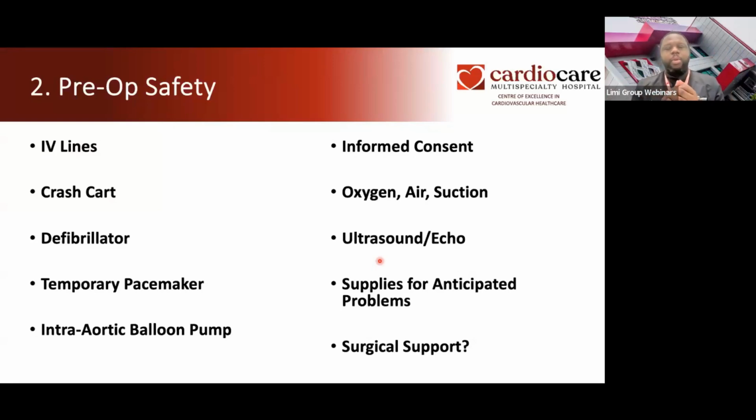Also, intra-aortic balloon pump, informed consent, oxygen, you must check it. You cannot start the procedure and oxygen finishes. Echo and ultrasound. You must have all supplies for all anticipated problems. Anything that can go wrong will eventually go wrong. And so you must have everything ready to tackle any possible outcome. And surgical support is a good idea, not always present, but it's a good idea.